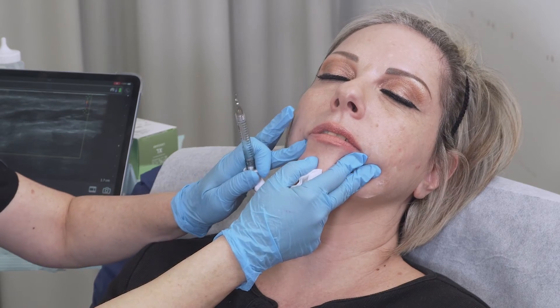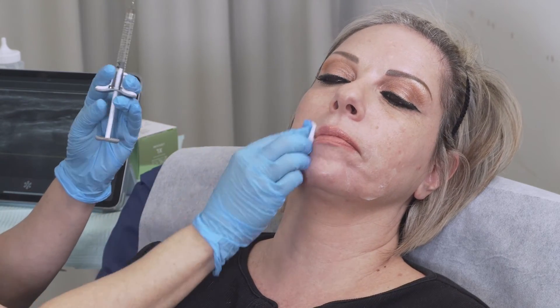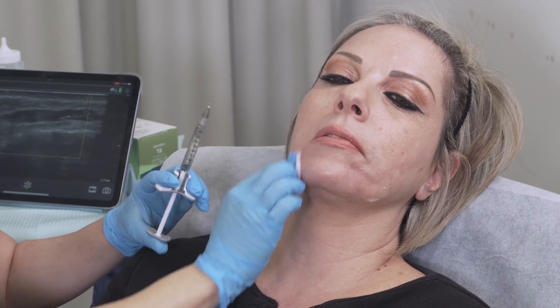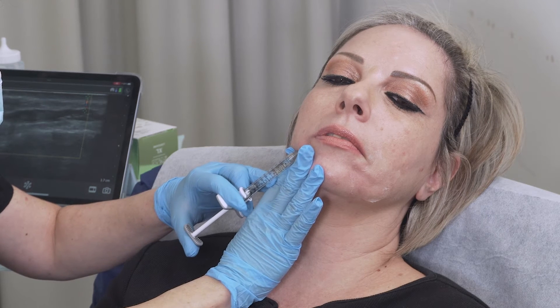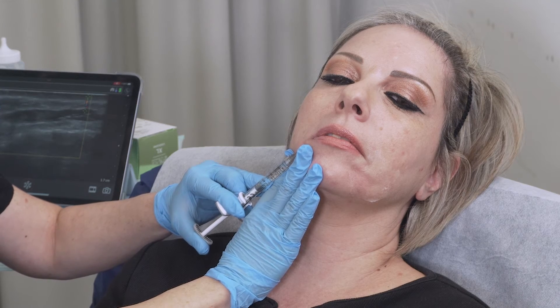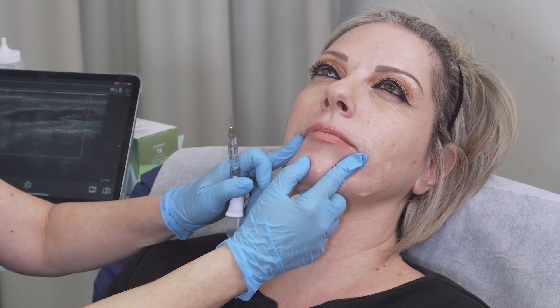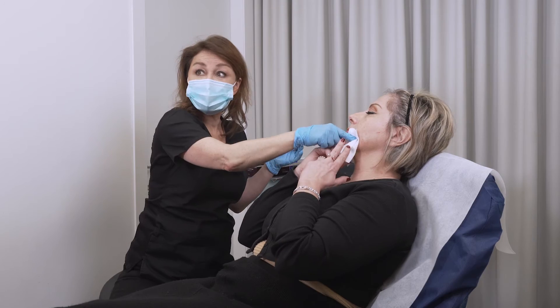The vessel was lateral to where I'm injecting — deeper and lateral to the injection area at this moment. So this side is done.